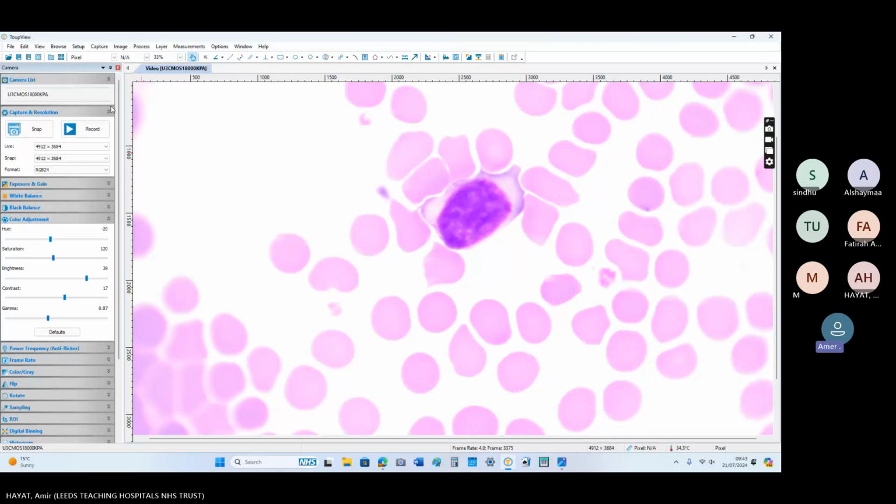The blood film shows lymphocytosis, most of which are atypical. They are different in size with basophilic cytoplasm and mature nuclei. The red cells and platelets are normal. The blood film is consistent with reactive nature. Further investigations are required to reach the final diagnosis.